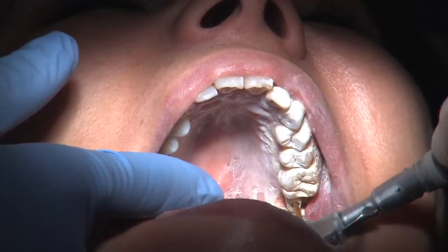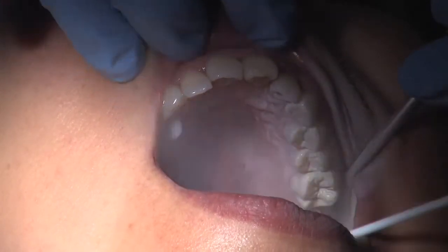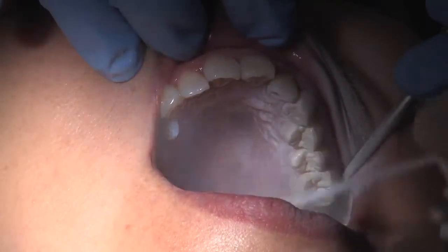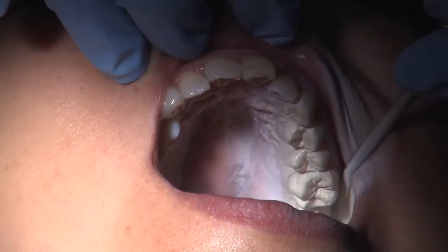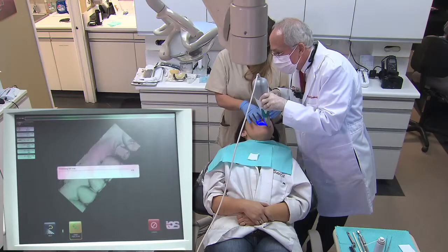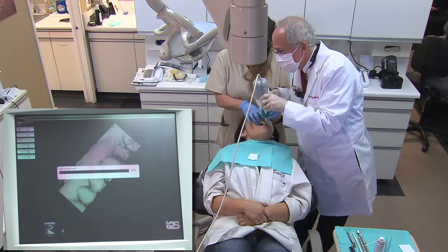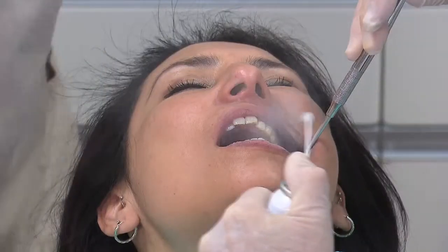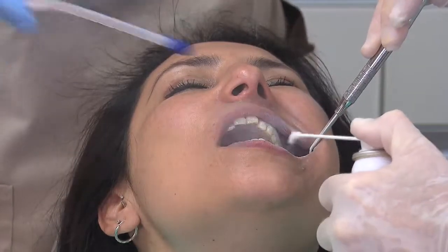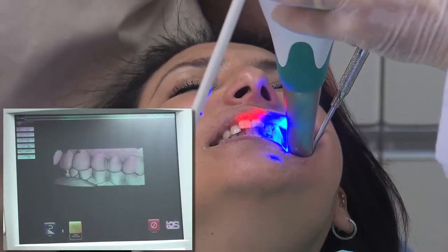The abutment screw is hand-tightened. If necessary, FastCoat material can be reapplied to any areas where it has rubbed off. Occlusal, buccal, and lingual scan images are captured. The final shot is of the bite — the buccal surfaces of the opposing teeth are coated, and a scan of the bite is taken.